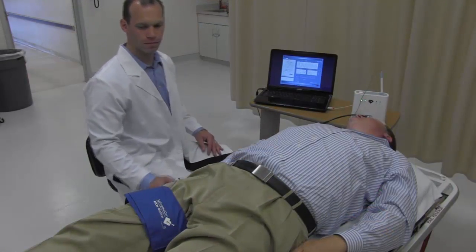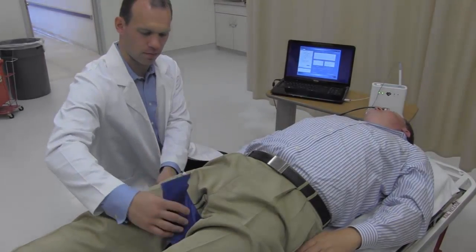Once an acceptable report is obtained, pulse wave velocity is complete and the cuff can be removed.